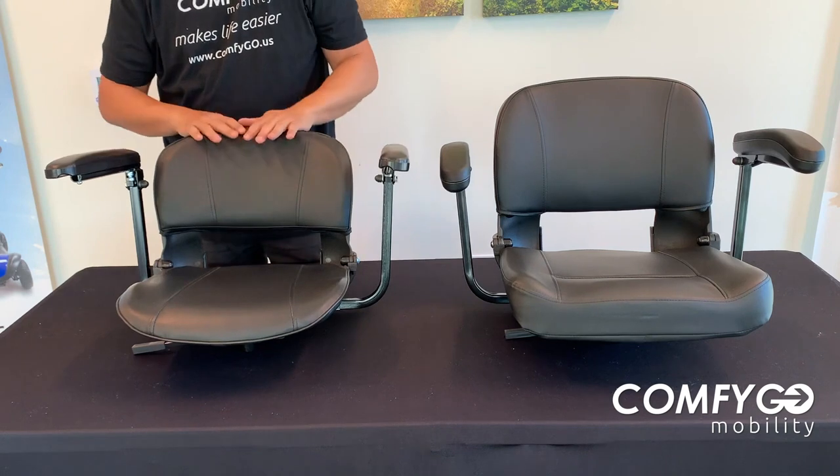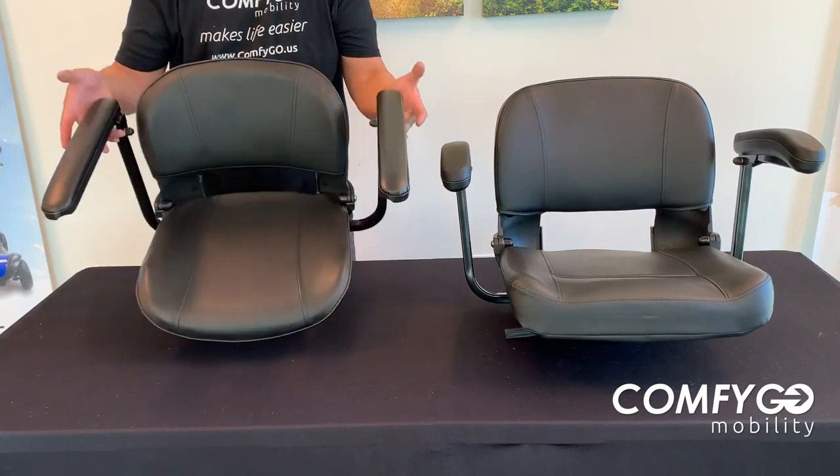This one is our standard seat — a little more lightweight, and you will save a little bit of money by going to the smaller seat here.